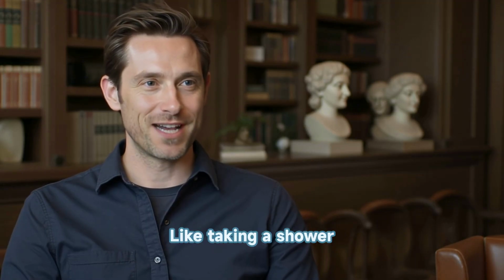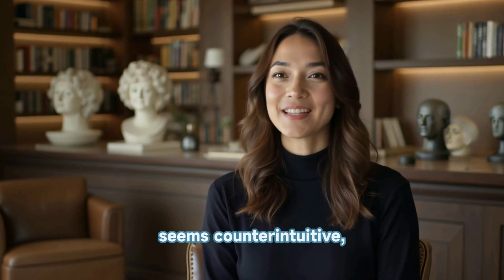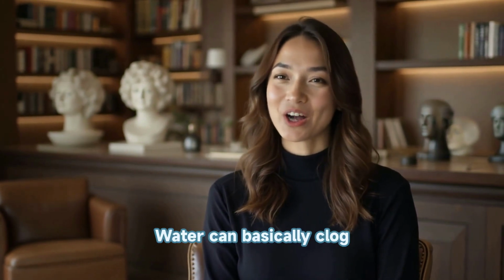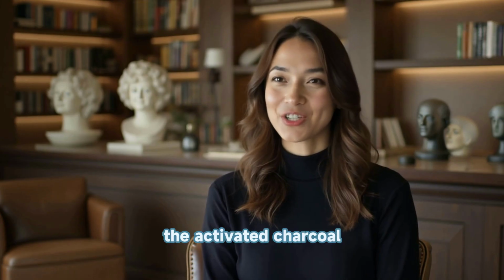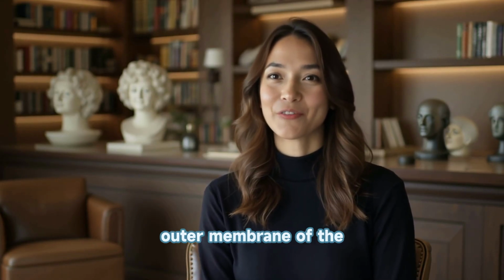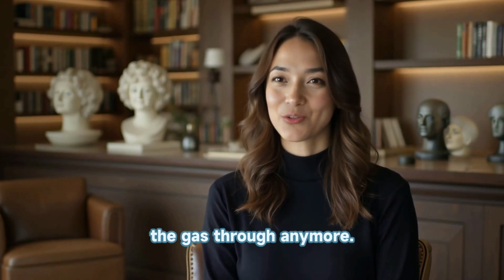Water. Like taking a shower or going swimming. Why cover it? Does it need to breathe? It seems counterintuitive, doesn't it? But the reason is purely practical. Water can basically clog the filter mechanism. Okay. Remember the activated charcoal we mentioned? If that gets soaked, or if the outer membrane of the filter gets blocked by water, it just stops working. It can't let the gas through anymore.